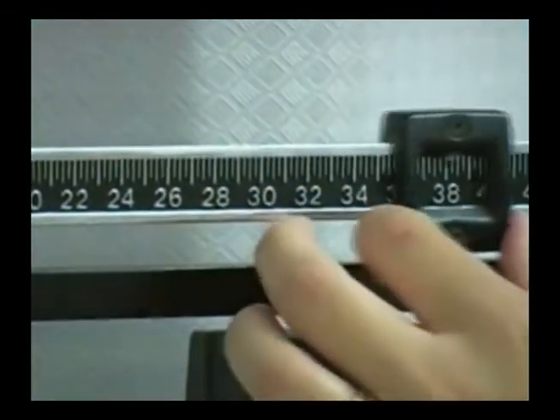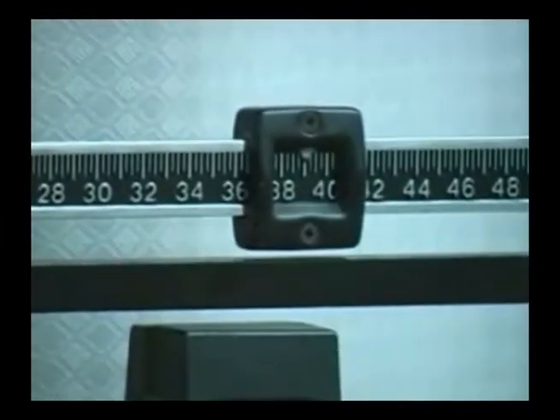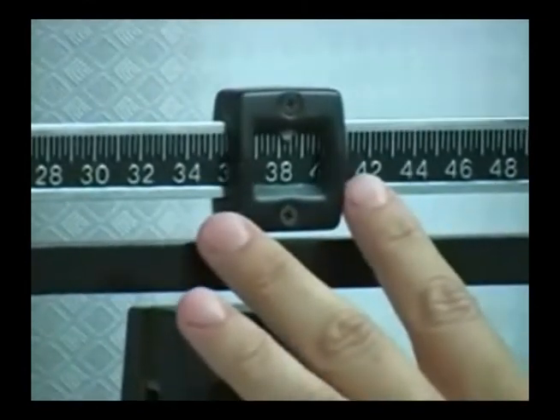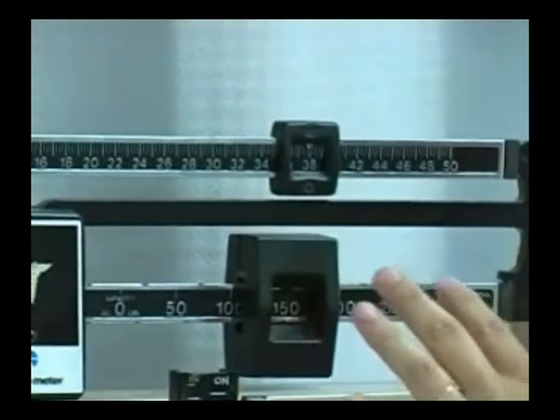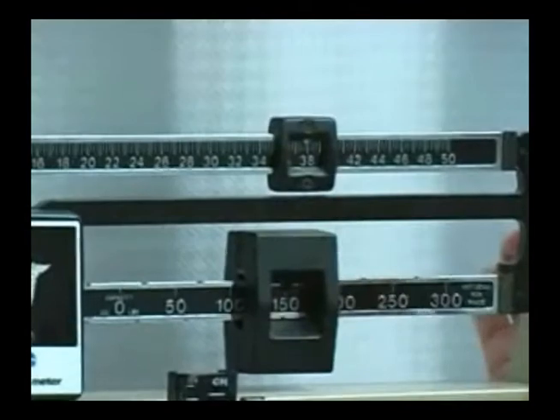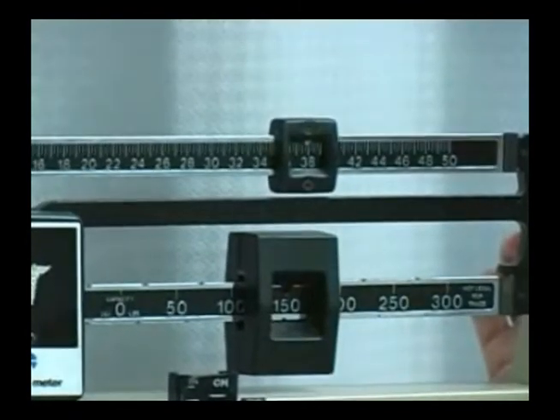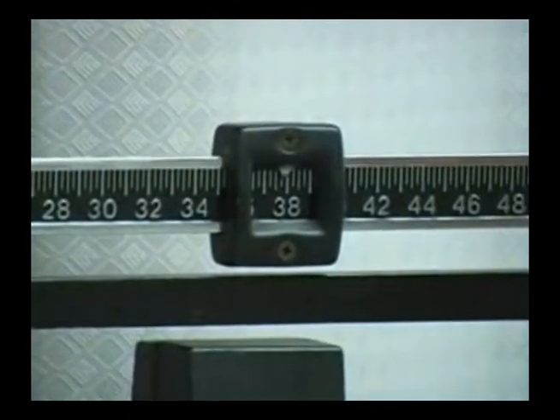If a person weighed 150 pounds, if we brought this over to 150, and the bar, if the bar would balance about right there, this person would weigh 37 and 3 quarters plus 150, which would put them at 187 and 3 quarters pounds.